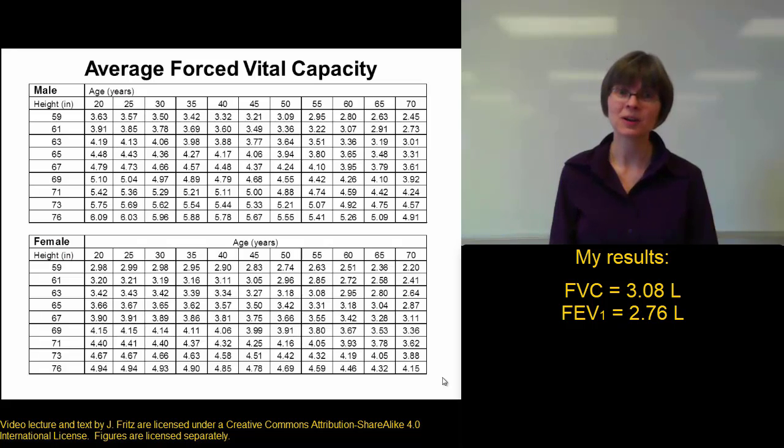The first number, the FVC, or forced vital capacity, refers to the amount of air you were able to move. So more is better. It means you have more lung capacity. And capacity can vary based on age, gender, height, level of activity, whether you have any underlying conditions or how well you feel. So there's a large variety there.